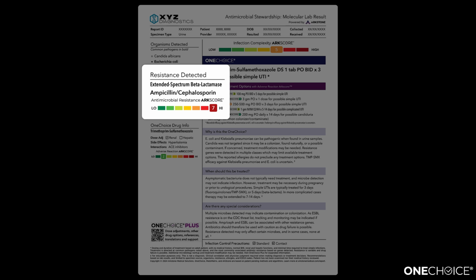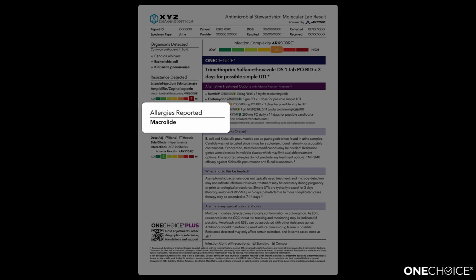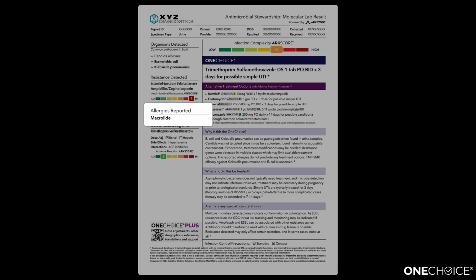The report also takes into account intrinsic resistance in certain scenarios, accounting for an organism detected that's known to harbor a specific resistance gene. Determining if a resistant gene detected has any relevance to the microbe or infection being treated is also factored in. Antibiotic allergies can also be taken into account, in addition to other factors such as pregnancy and diagnosis codes sent by the lab, ensuring a targeted recommendation and report for the provider.